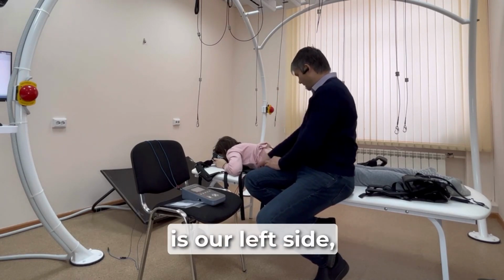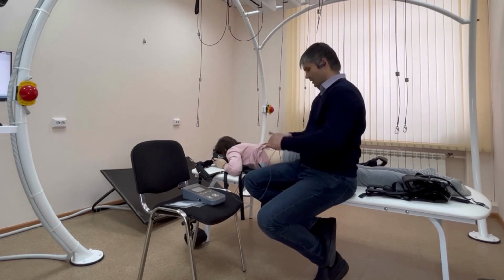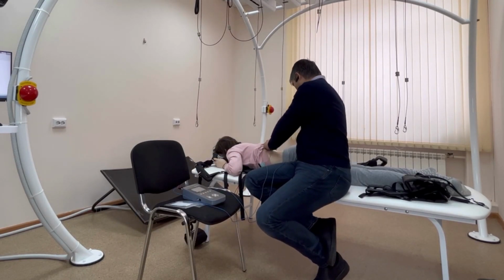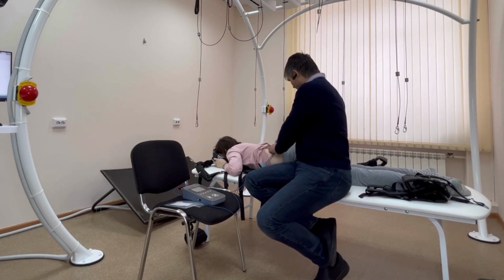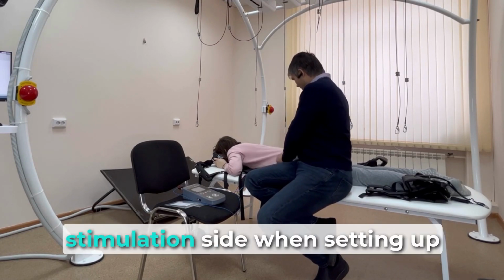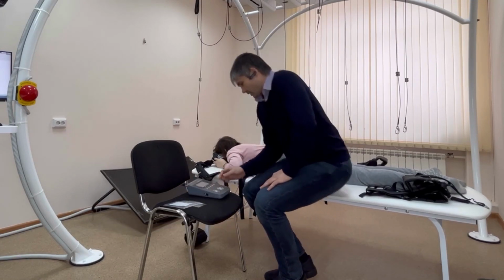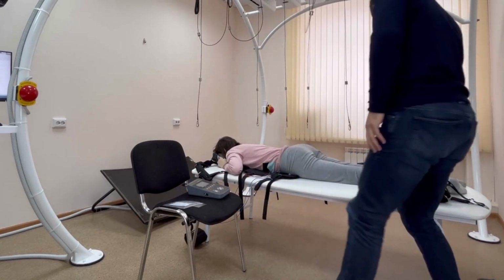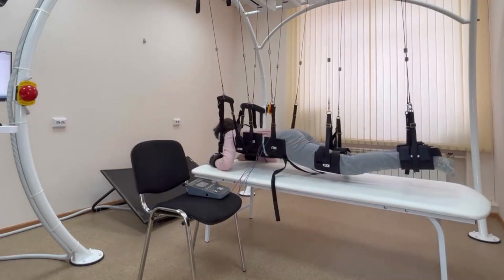You also need to not confuse that the first channel is our left side, and the second channel is our right side. Be sure to indicate the stimulation side when setting up the channel in the program. We secure the cuffs and raise the patient to working height.